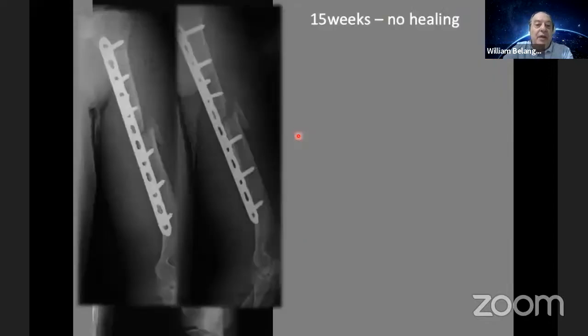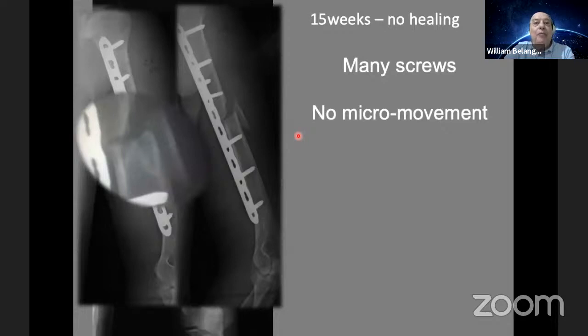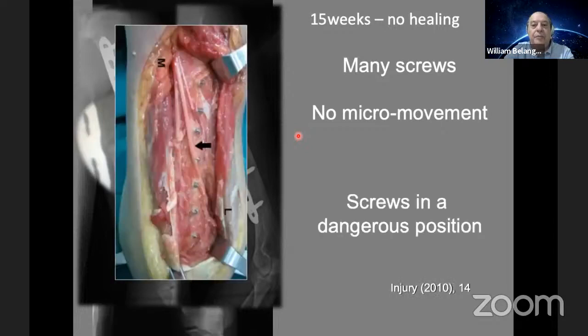But this is another case. You see, 3 locking screws in distal and 4 screws in proximal. Okay, 15 weeks, no healing, no bone formation. Many screws, no micro movement between the bone fragments, no callus formation. It's very important to avoid this. This is a doctor complication, not just a fracture complication, not just a method complication, it's a doctor complication.